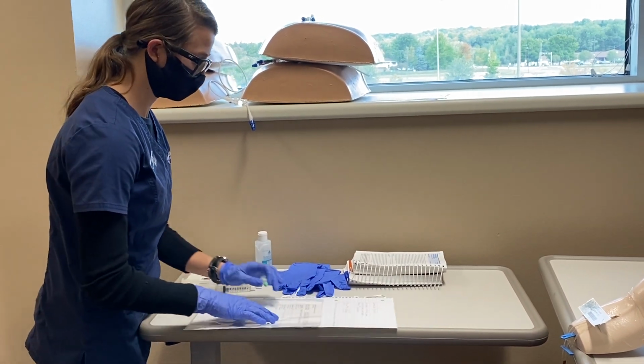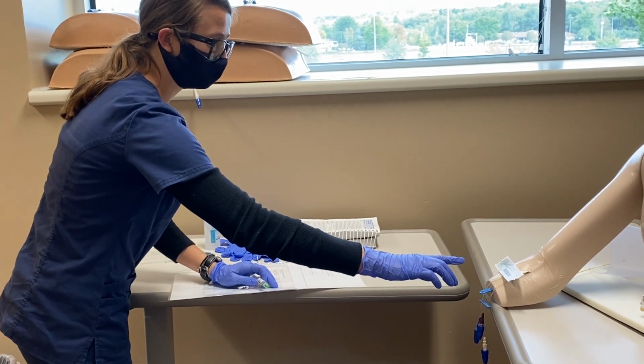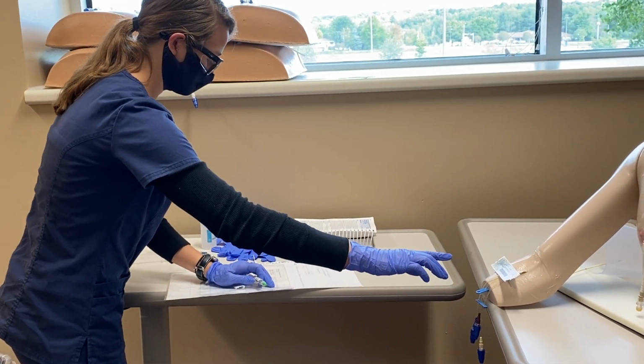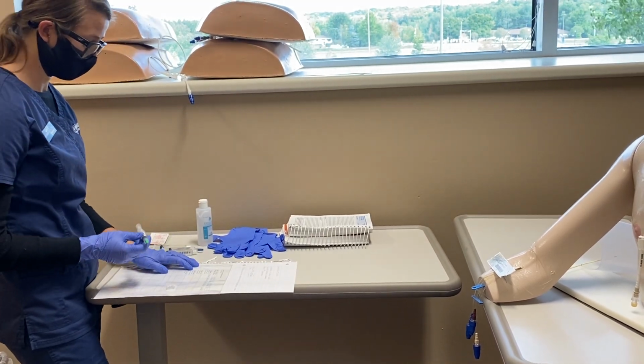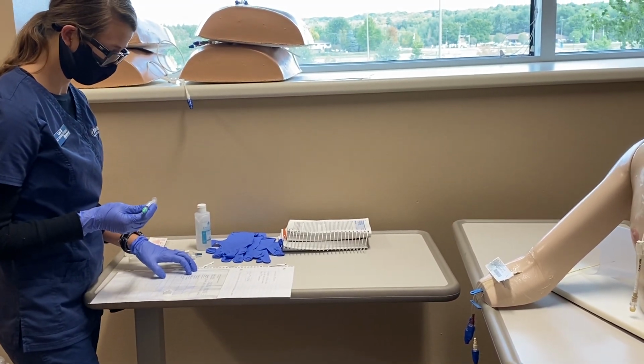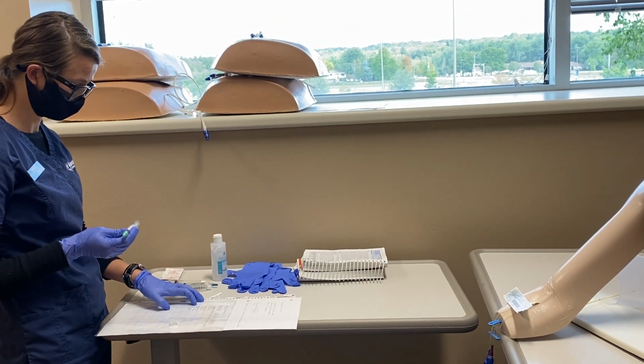So I'm just going to do a check here. So I have Bob Owens. Bob Owens' birthday is 9/22/1933. He's allergic to morphine, and I'm administering hydromorphone today.